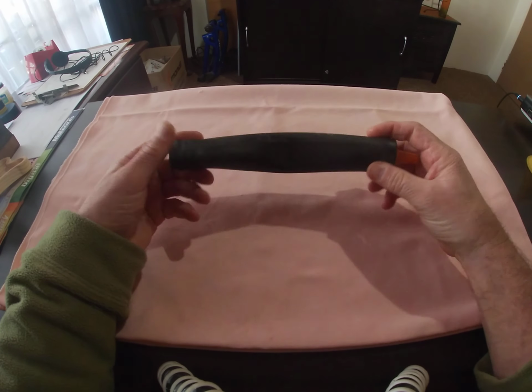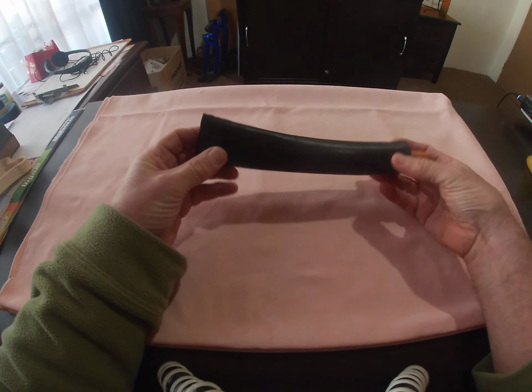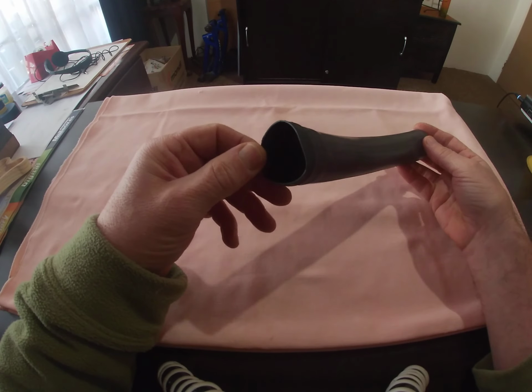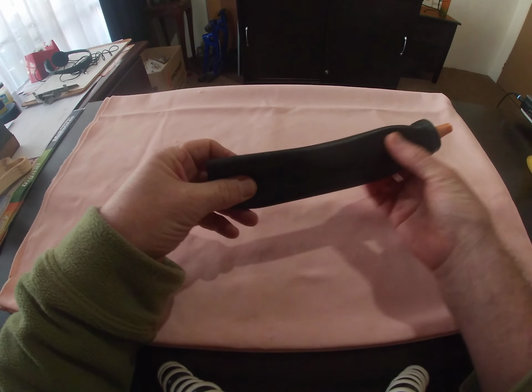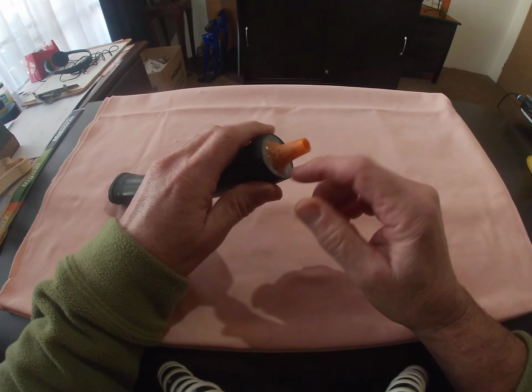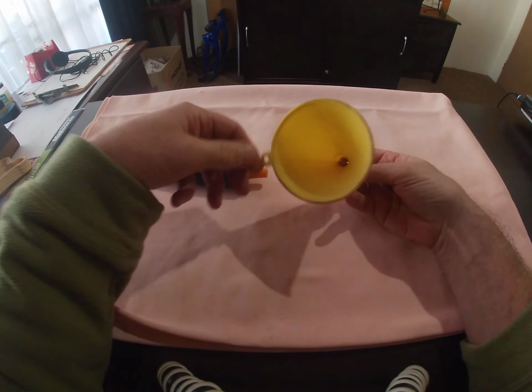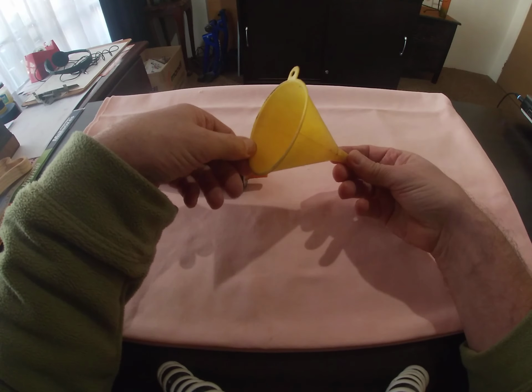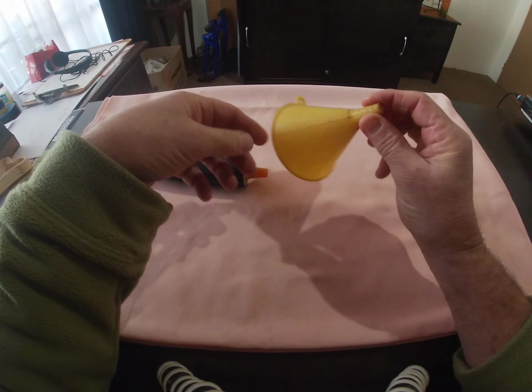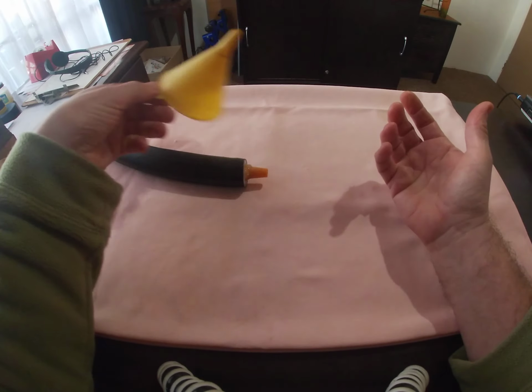First of all, you're going to need a piece of mountain bike tube. I believe this is a 210 to 230 size mountain bike tube. This is partially put together, so I didn't want to remove this. This is a part of a funnel, and you can buy funnels in sets, but the funnel cannot be that big. If you've got one this size or smaller, it's going to be fine.